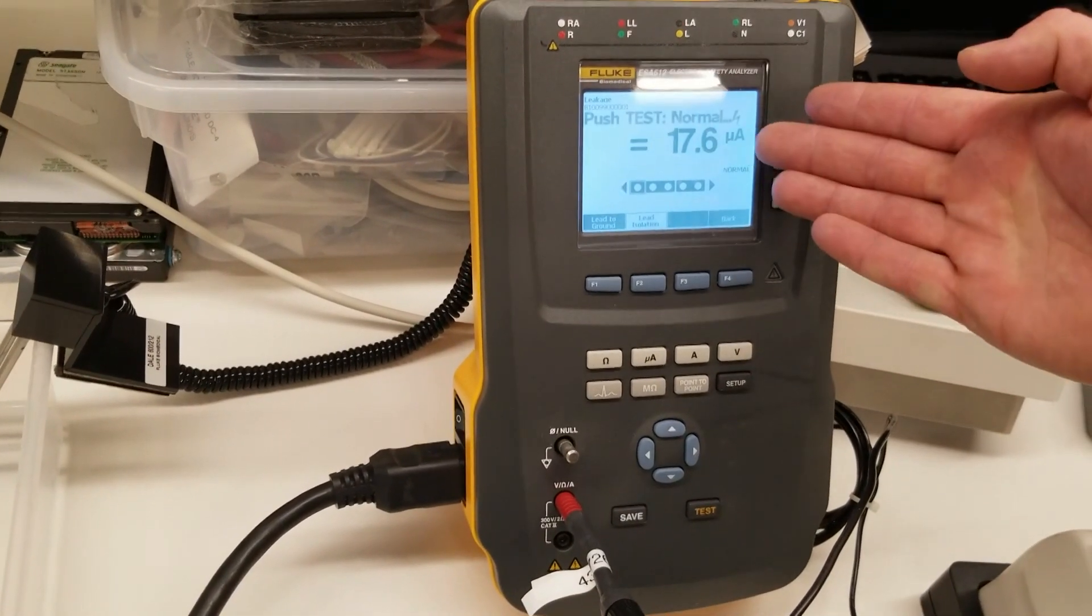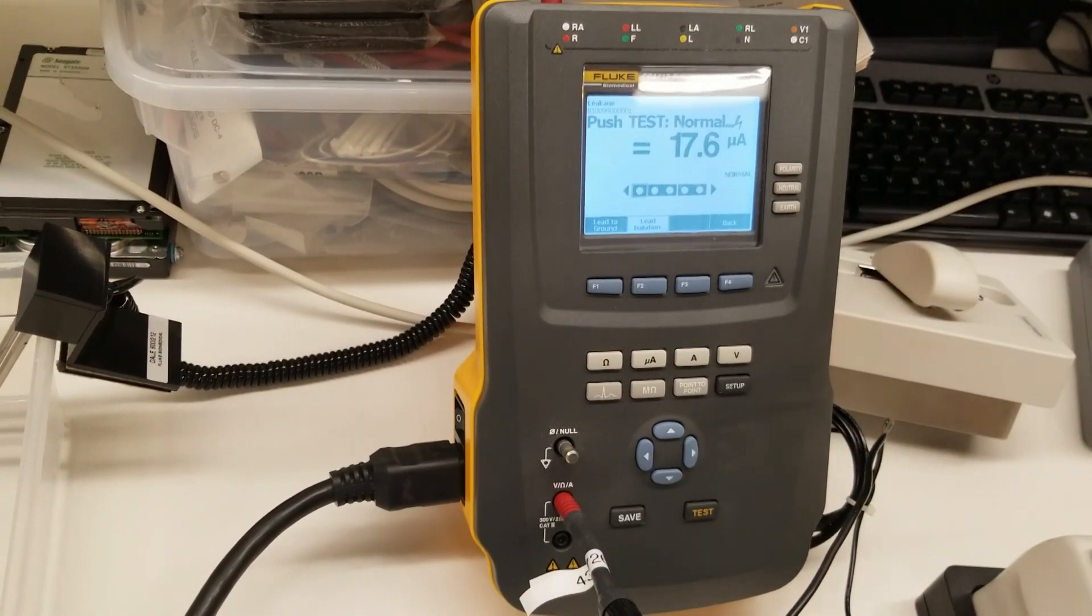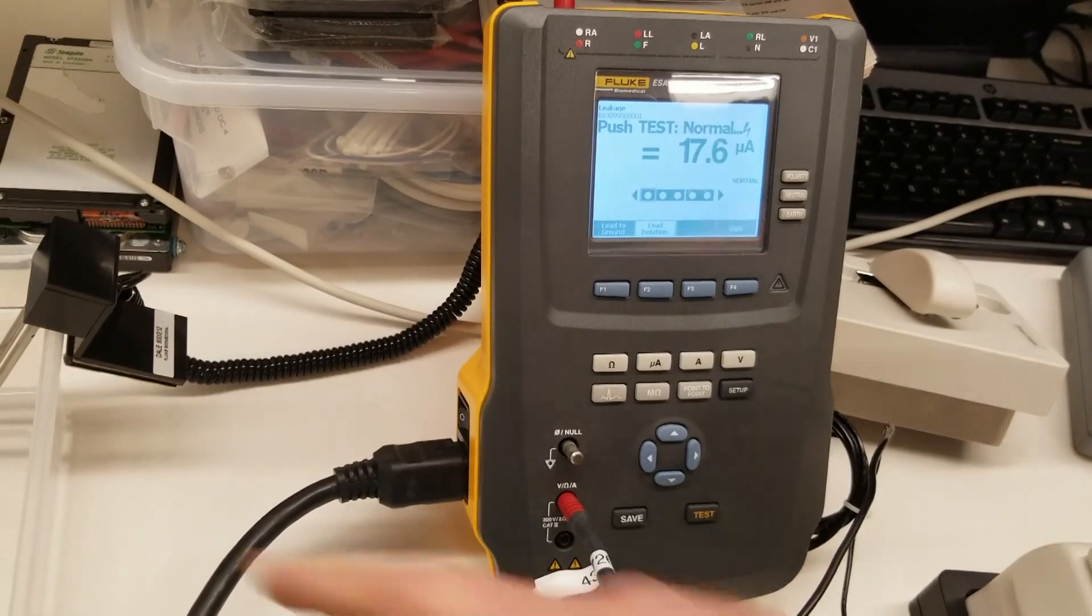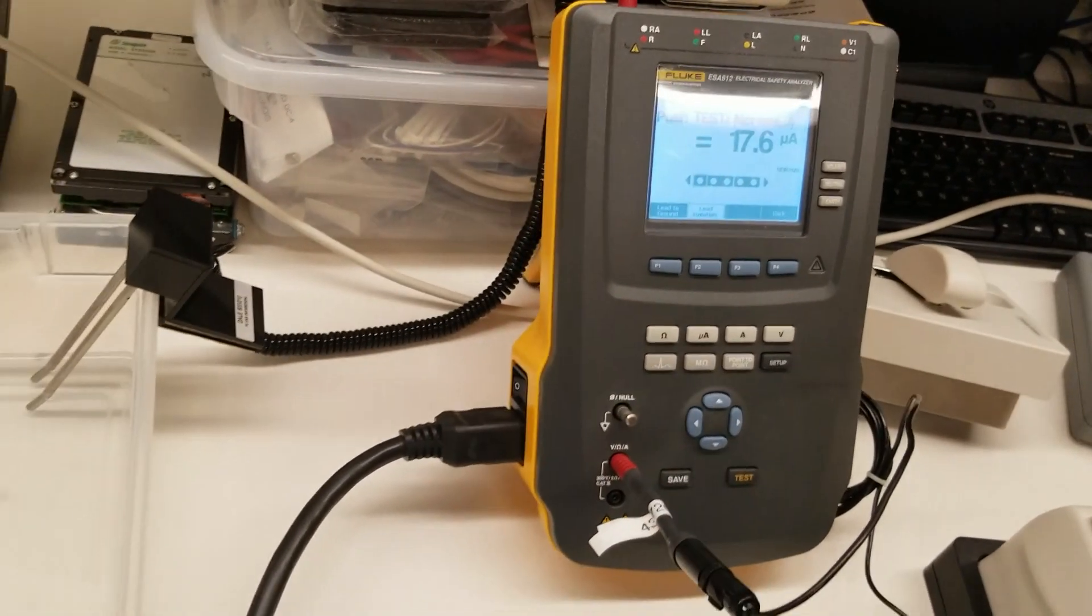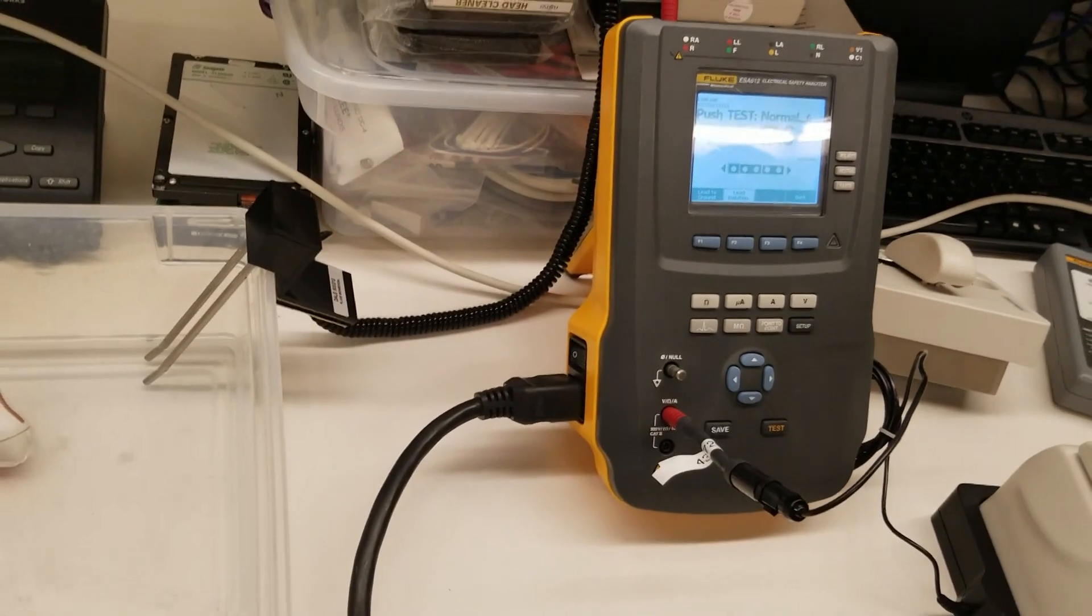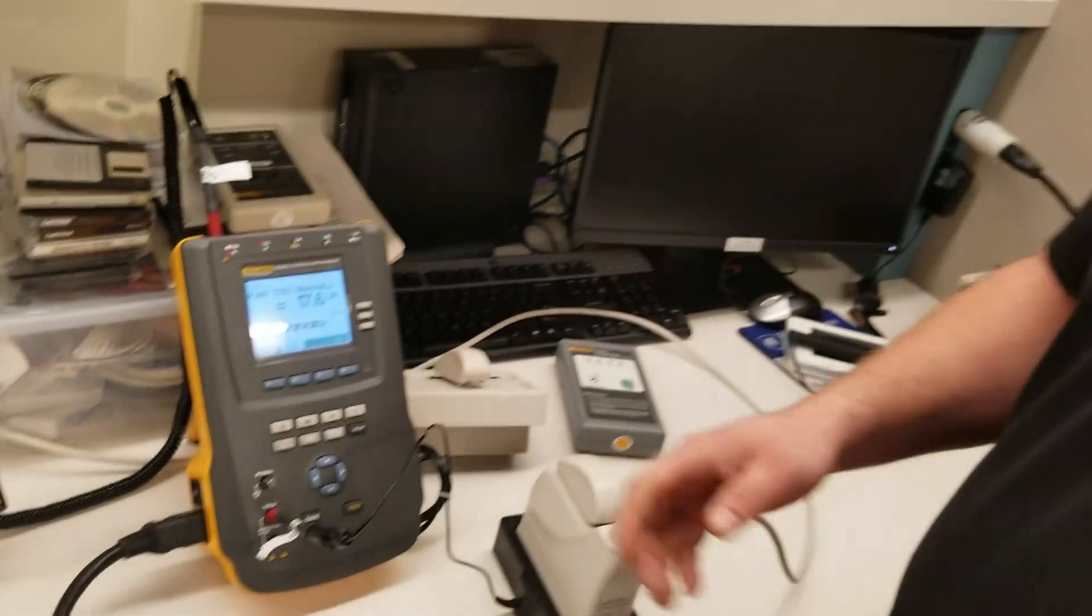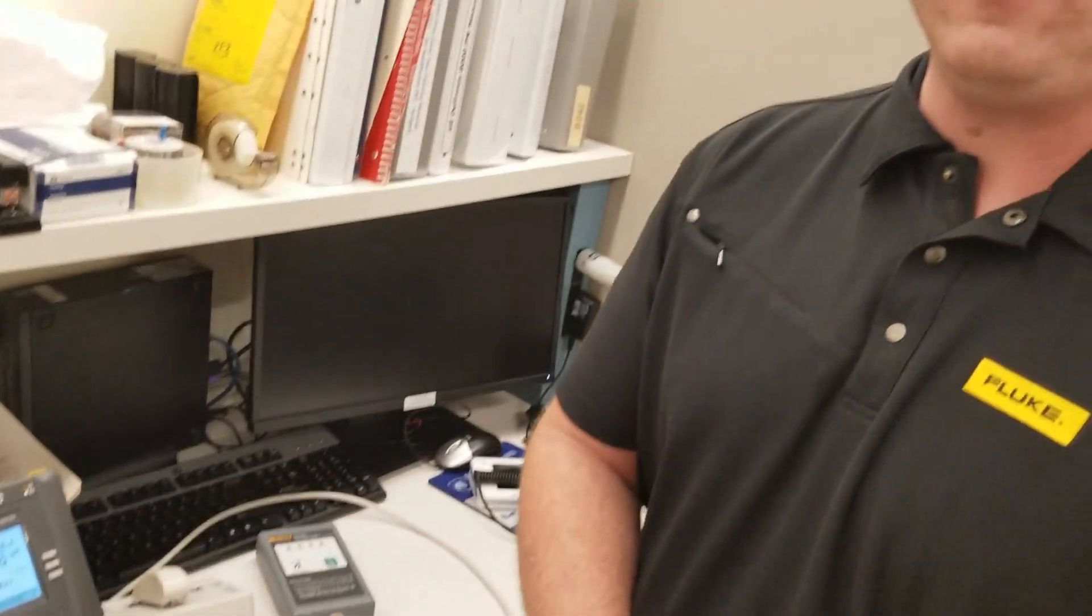And there you go, we have 17.6 microamps of leakage current for our ultrasound probe. That's a nice quick easy way of finding out the exact leakages.